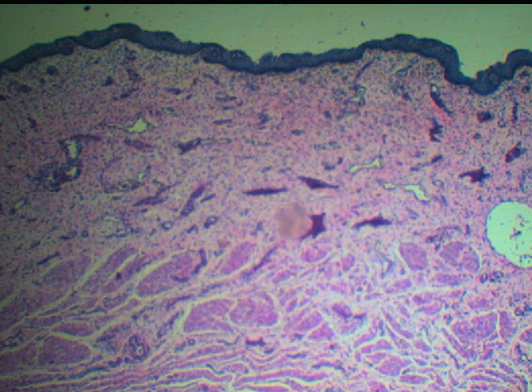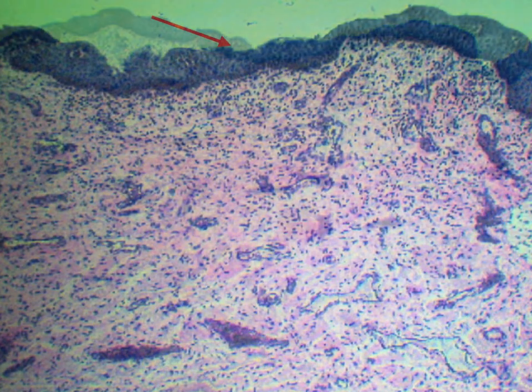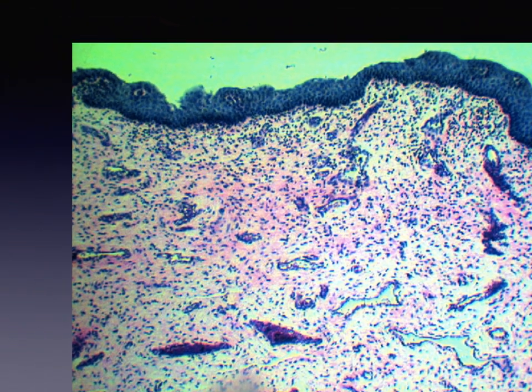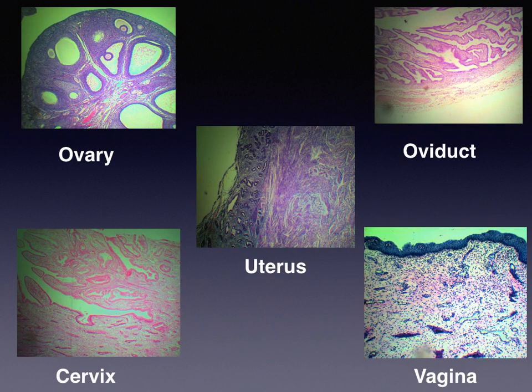Again, this is a higher power magnification of the lining epithelium of the vagina, which is a stratified squamous non-keratinized epithelium. End of lecture. Thank you so much.